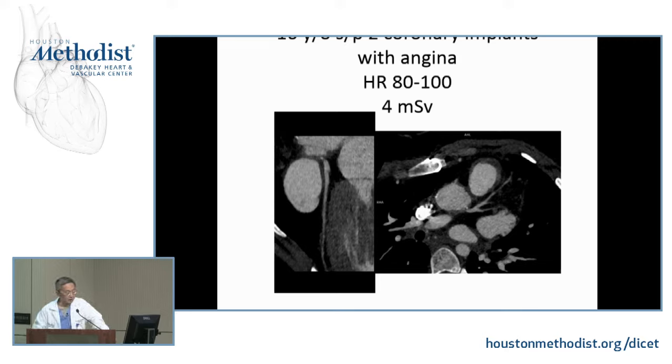And obviously, we weren't going to do the same thing because of the scanner we have. We took advantage of the superb temporal resolution and dual source.